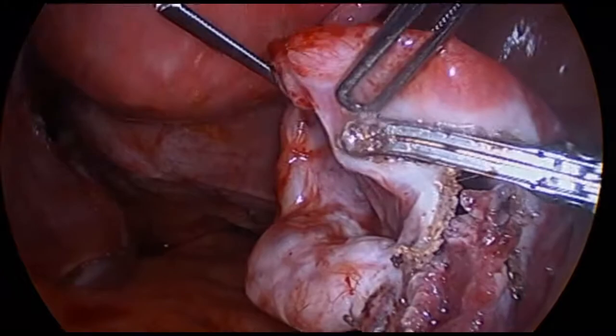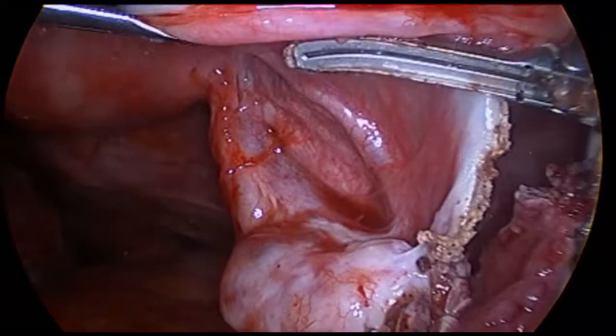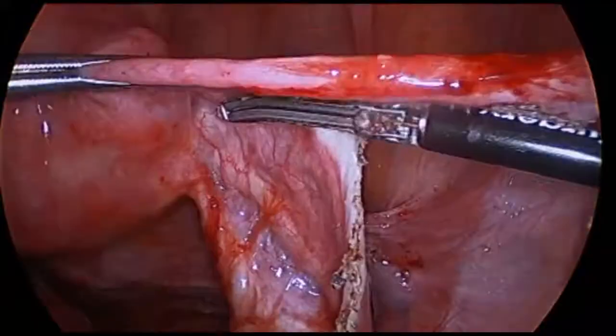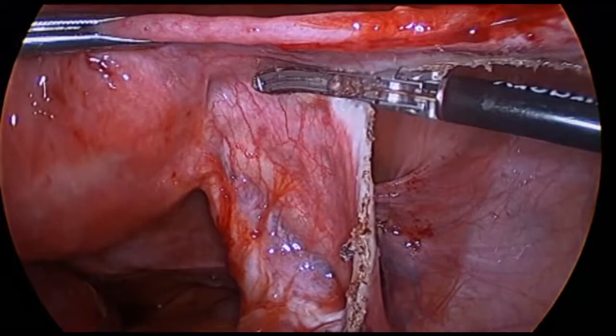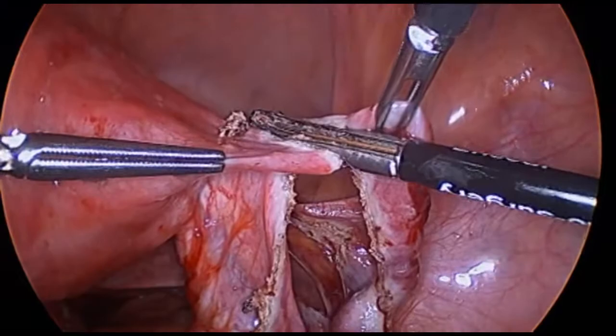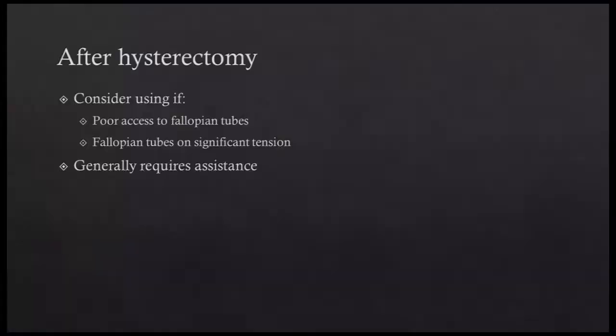Any fimbriae that are left behind can be removed after completion of the salpingectomy. As the dissection proceeds medially along the length of the fallopian tube, the assistant releases the lateral grasper and repositions the tissue to maintain parallel tissue presentation to the vessel sealing device. As the uterine cornea is approached, the fallopian tube can either be left attached to the uterus as the rest of the hysterectomy is completed, or can be amputated and removed separately. We generally suggest amputation followed by immediate removal as the dangling fallopian tube can obscure visibility during the remainder of the surgery.